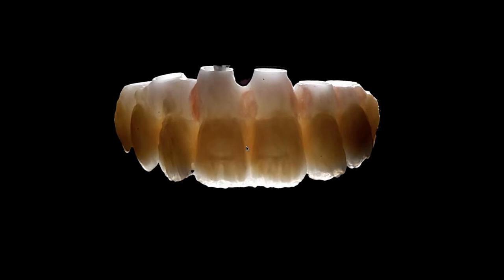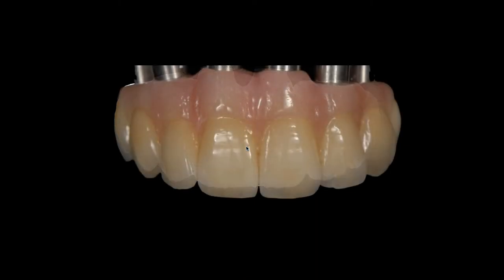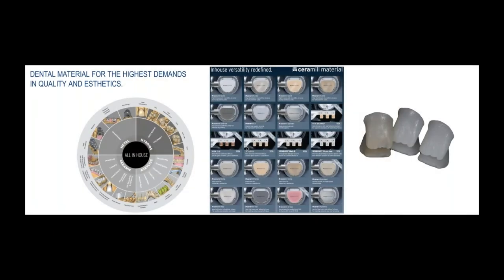So again, I don't ever want to sound anti anything. I love translucent materials. I think they're great for us, and I like that I can get more and more light transmission. But in the end, I have to be able to either use enough materials to make that opacified to look like nature, or maybe I'm just using the translucent materials for more monolithic restorations, which is fine, but I need to know when, where, and why. So I think we have so many materials to look through today, and I think that's wonderful. I'm excited about that, but let's be clear.